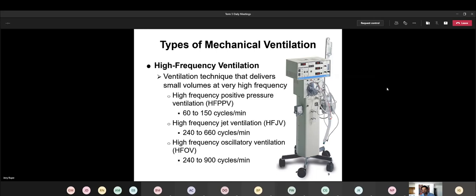So the manufacturer has literally taped it to the top of the machine. So these are all your steps right here that you would have to follow. Kind of similar to like the ventilator in the lab, where it was telling you to go step by step to do something, and now do this, now do that. It's all written here, and you just kind of follow it. And then that way you'll be fine.